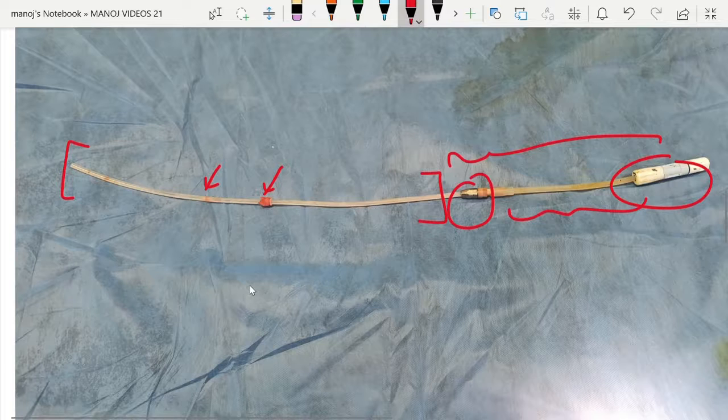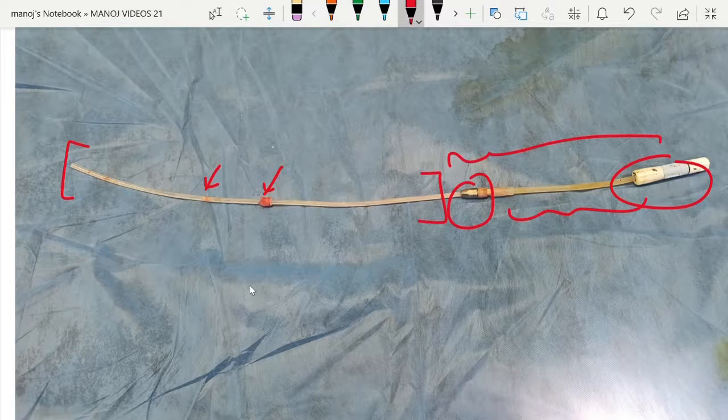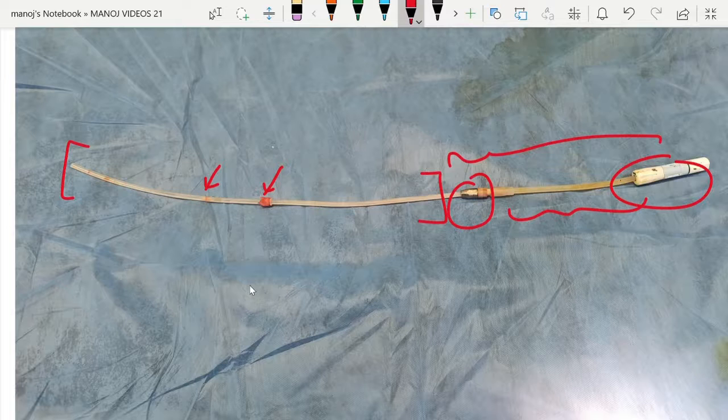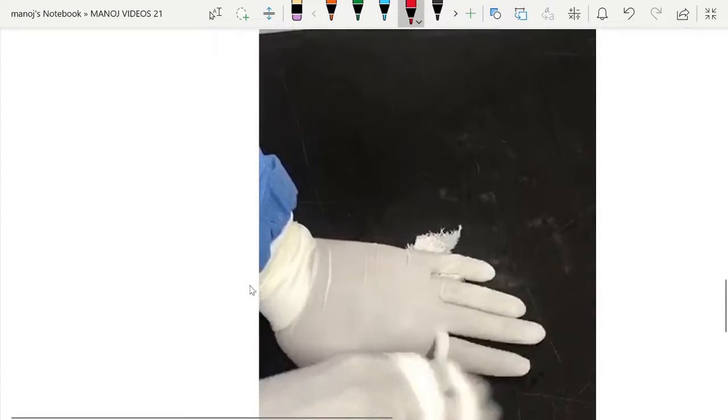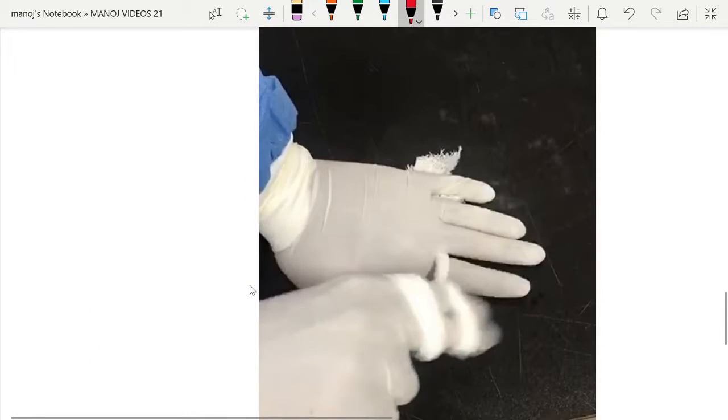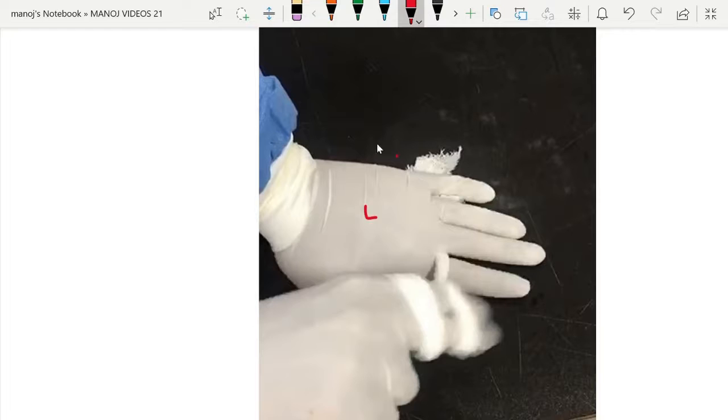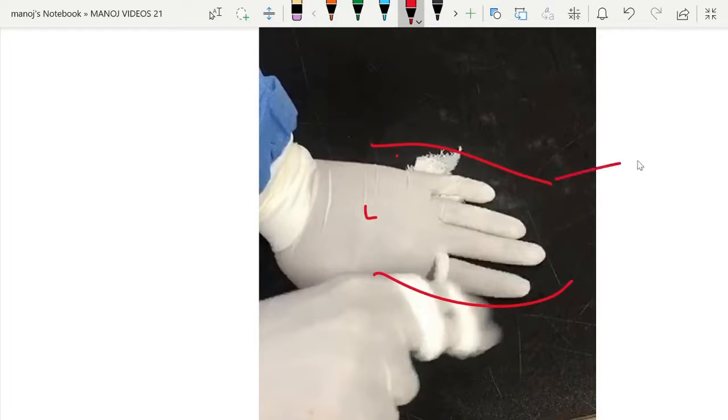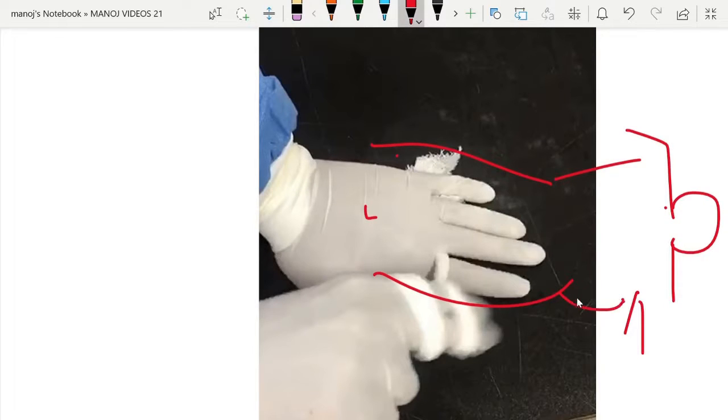After dissecting it, we pulled it. Pulling that part is the most difficult part of the CAPD catheter removal. How to pull it? Here I am showing a demo. With one hand you have to give pressure to the abdomen.